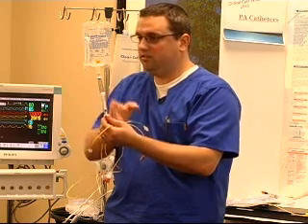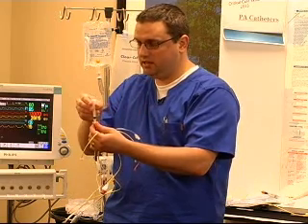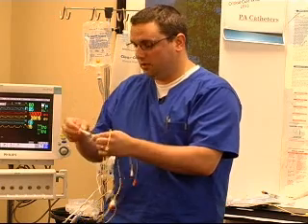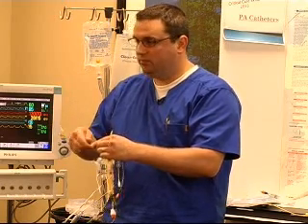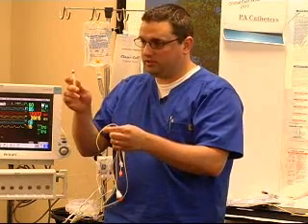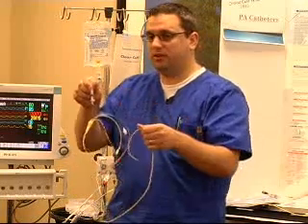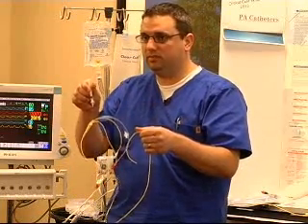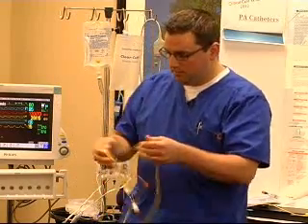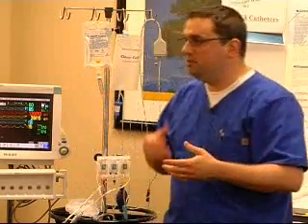When they're in line, that means it's open. It's kind of like a track. It won't flow through the track if it's offset like this. That's about the only time you really use the locking device on here, because when we put this in the position where we would leave it once the wedge balloon is down, we want to make sure that there's no air in here and that it's open. From all the way to the back of the room, you could tell me that there's no air in that balloon because you know it has somewhere to go and the gate's open. That's a way of ensuring that you don't accidentally have your catheter left in wedge.